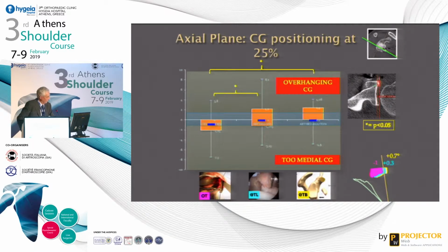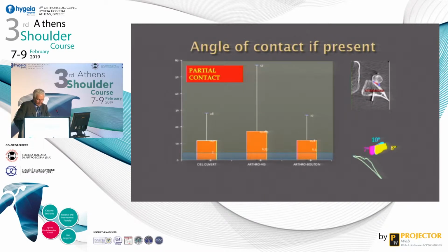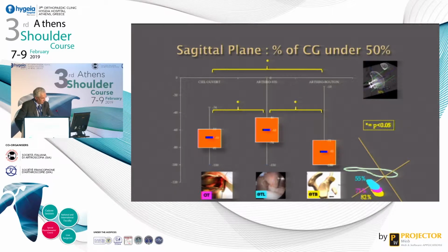You can have some overhanging with a different arthroscopic technique. It's less with the open technique. But the endobutton, the posterior guide, is definitively better. And you see the contact of two pieces of bone and the angle of contact. It's always better with the endobutton. And you see the positioning of the graft.